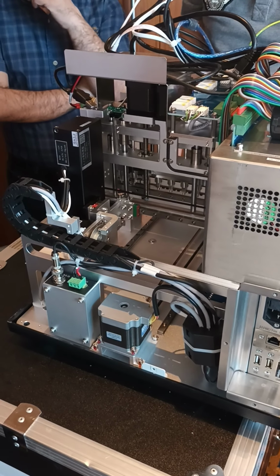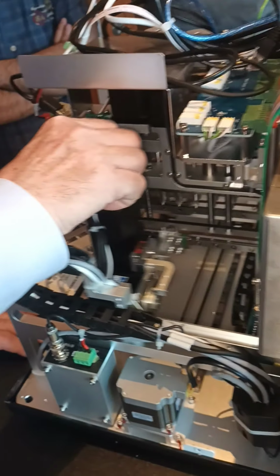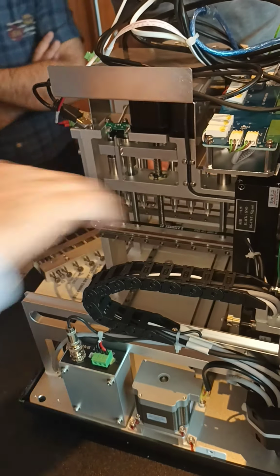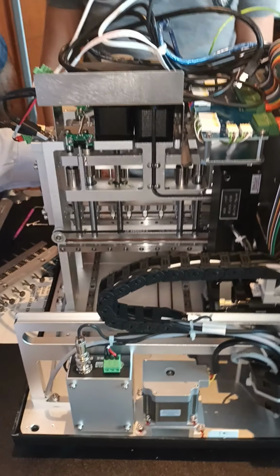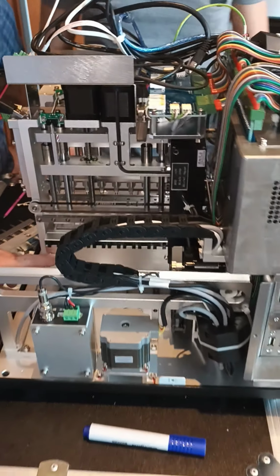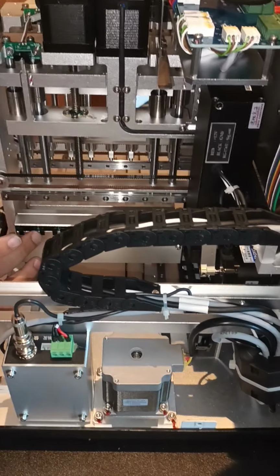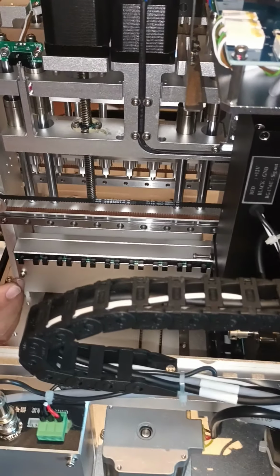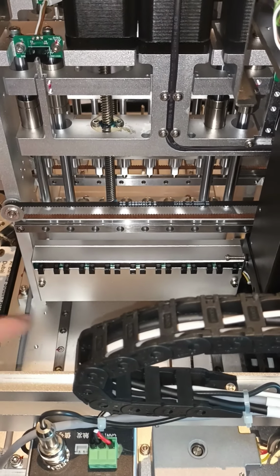Now, this one we finish with. We need to do quite a few things in here. Before we proceed any further, let's move it back. We have to take back the cover of this one. We go in here. We take now these 2 screws. What does the interrupter sensor do? This one is for the syringe. So 1, 2, 3, 4, 5, 6, optical reader. That's it. So take out these 2 screws.